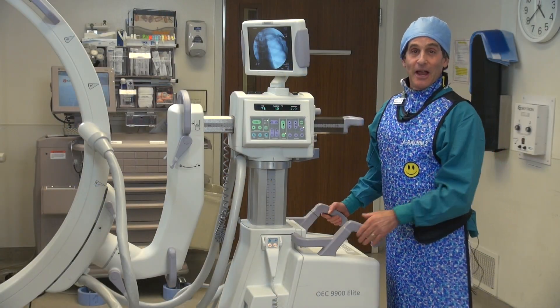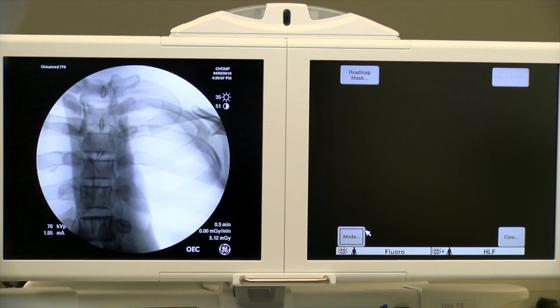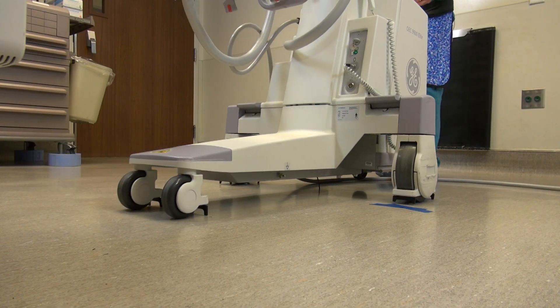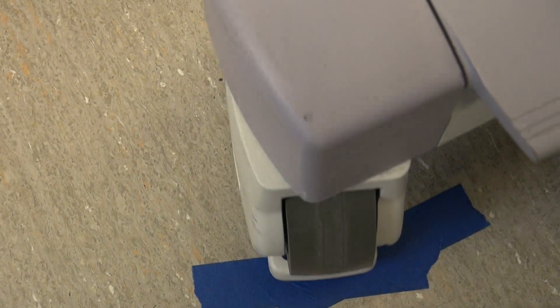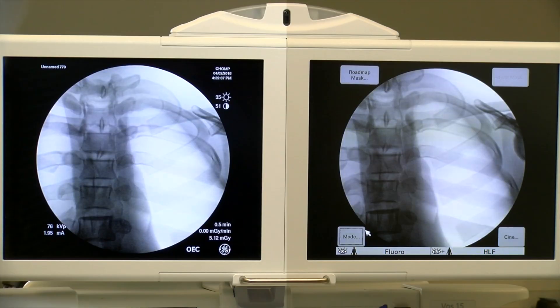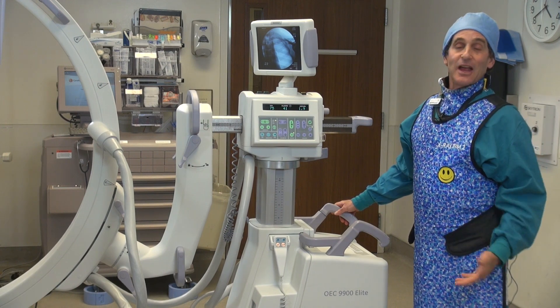So now I'm going to go ahead and turn the tires that little bit of 20 to 30 degrees. And you can see right here that we have just that right up at that top rib. I'm going to go ahead and now turn the wheel so that it's at that 20 to 30 degree angle, and so now we'll go ahead and back up at that angle. Here we are backing out, and now I'm just going to go back in and stop right where we were. I'll send that image over to the other monitor, and here we go — make the new exposure. And you can see that we're almost exactly perfect right where we started. It just is amazing how that is the way to do it. Anytime you're going to back out, back out at that angle and don't go straight out.